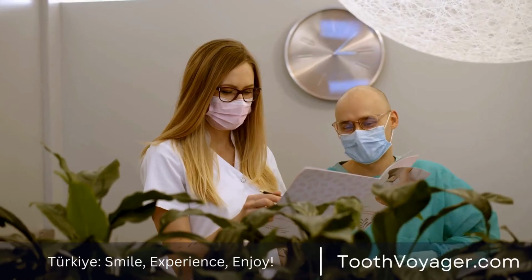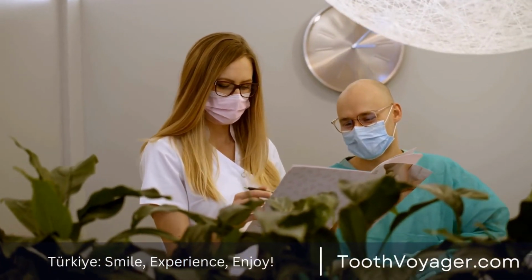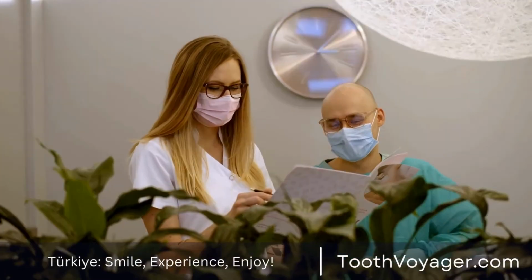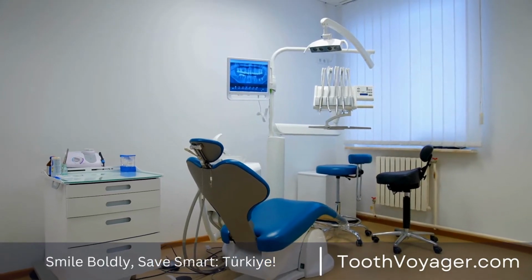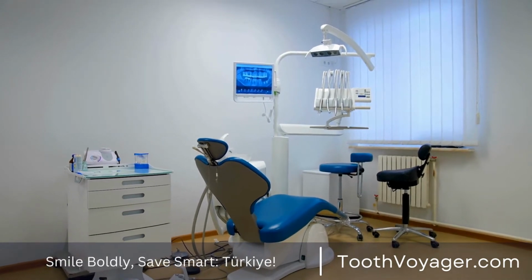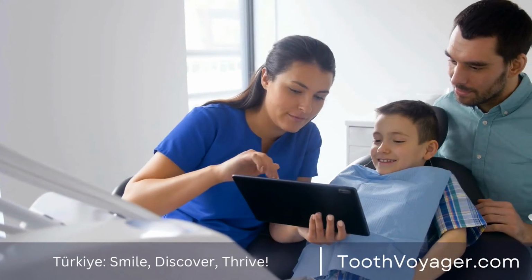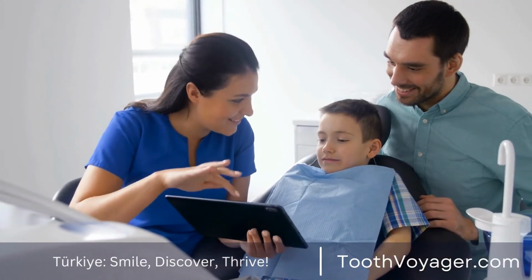Treatment planning. After the consultation is completed, the dentist will then work with the patient on an individual treatment strategy. The plan will outline the number of implants required and the kind of implant to be put in, as well as the time frame for the treatment. Dentists will also talk about the potential risks and issues that could occur during the procedure.